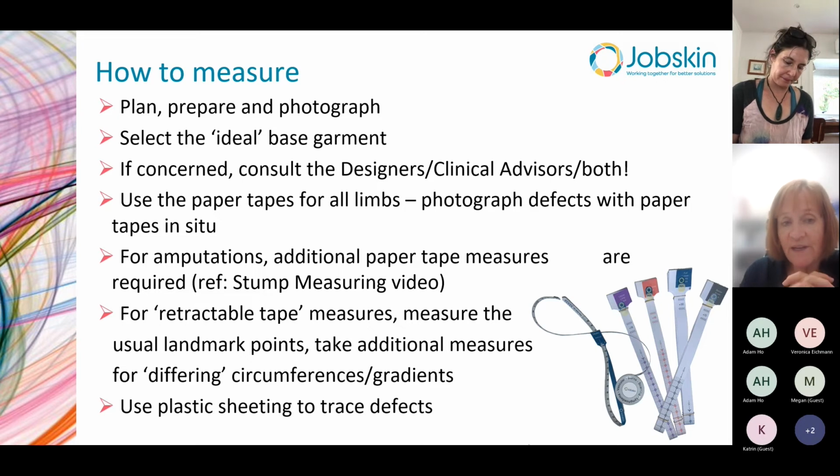And it's a really good idea to take photographs with the paper tapes in situ on limbs, or if you've got a tricky part of a torso that you're measuring, put the tape measure on and take a photograph with the tape measure on. It's absolutely invaluable information for the designers.